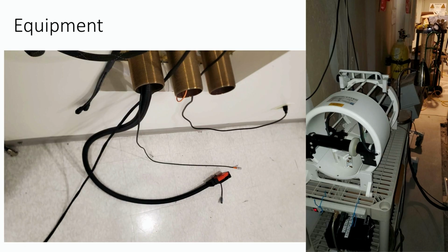These are shielded cables. There's copper Litz wiring in the TMS coil, but the cable that goes from the wall to go inside the bore is super long. And so as a factor of the filtering and the length of the cable, the amount of juice you can deliver to that target is not going to be as high as with your little clinical machine or behavioral machine.